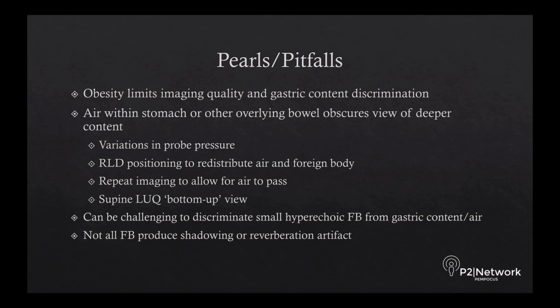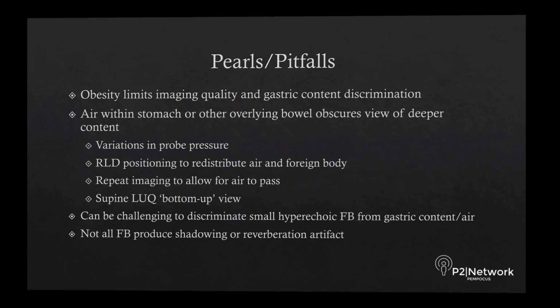It can be challenging to discriminate small hyperechoic foreign bodies from gastric content or air. And once again, not all foreign bodies produce a shadowing or reverberation artifact, which can make them really challenging to discriminate from other ingested content such as food.